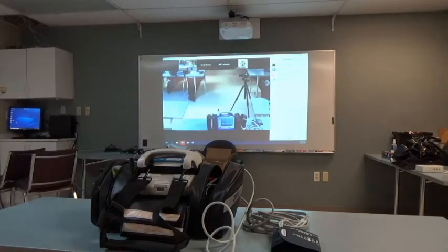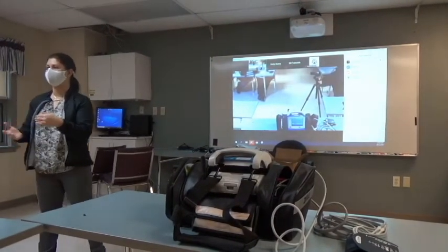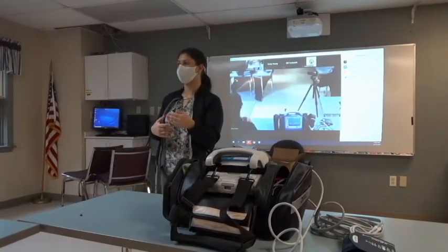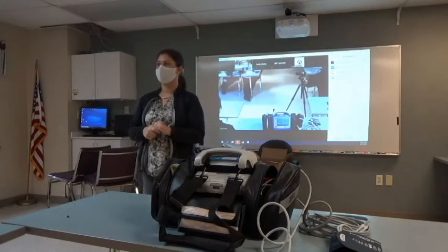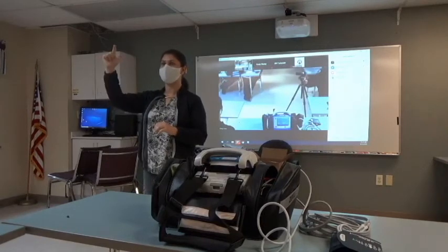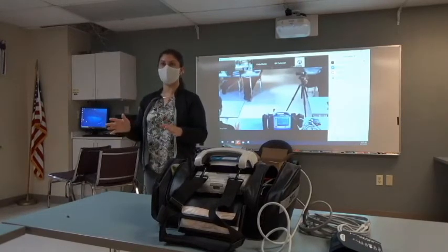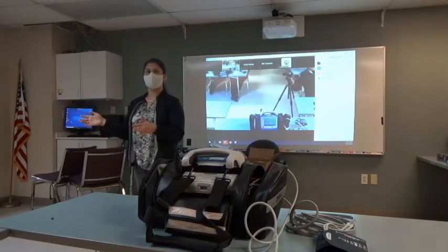Thank you. Yes. It's not automatically charging. Right, you push it twice. The reason you're pushing it twice is because it wants to confirm that that's the energy that you want to deliver. So when you hit that charge button, the second time is a confirmation, yes, that's the joule setting that I want. So if you press it twice, it starts going up and you hit energy down, it'll disarm. Is everybody comfortable delivering energy and disarming the energy? Yes. Okay. So if you guys are good with manual defibrillation, we're going to move into cardioversion.